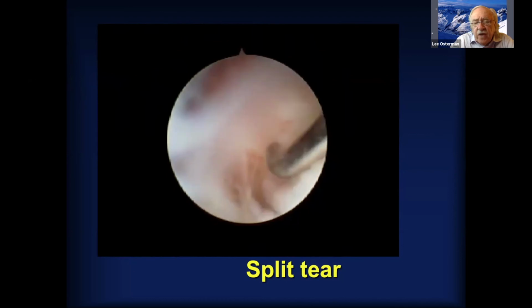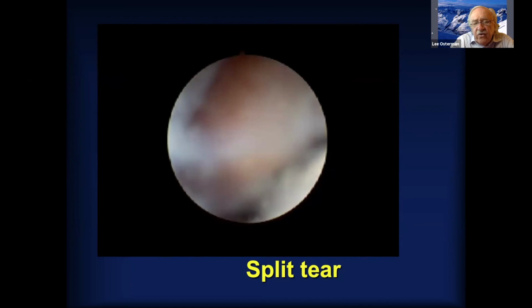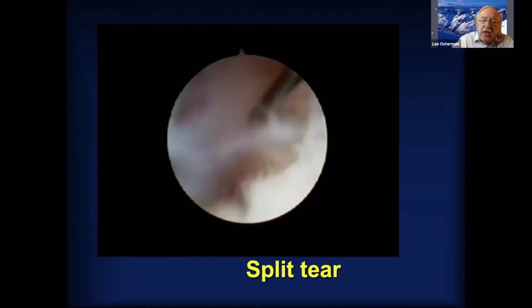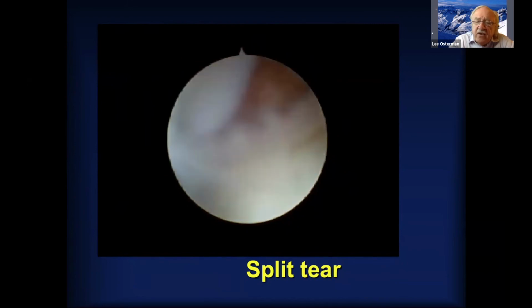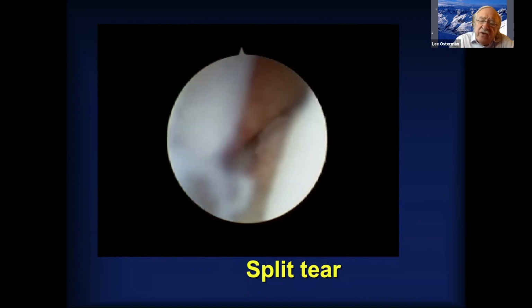We'll try to clear things out here in a second. This is real time. And as we start to come down the prestyloid recess, you're going to see behind all that fringe, you'll see this kind of defect between the two fibers where the ulnar extrinsics are running. And it's a fairly easy diagnosis once you've seen it. You start at the pisiform recess, the prestyloid recess, and it just opens up like somebody's unzippered it.